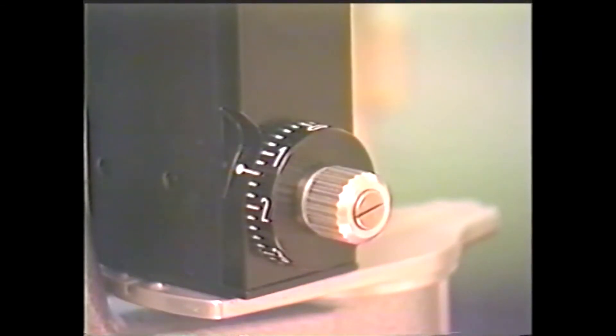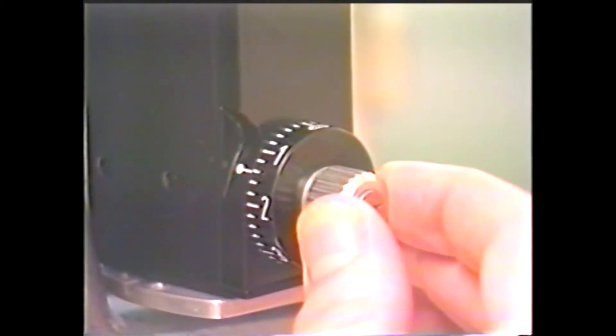Next, adjust the tonometer's knurled knob to apply the needed force to produce the endpoint: inner circle touching inner circle.